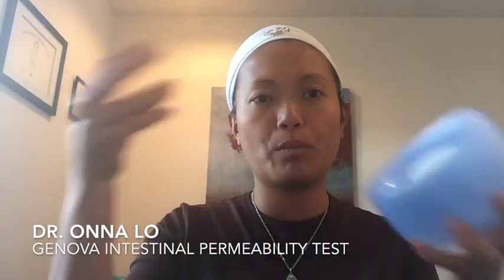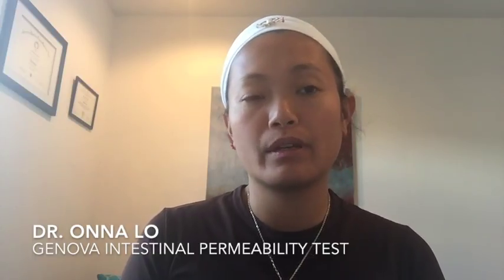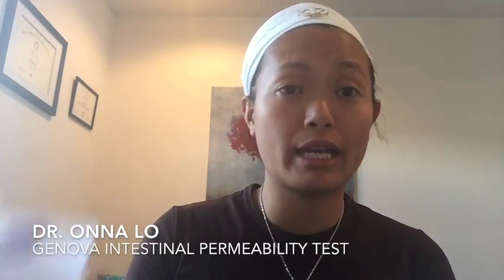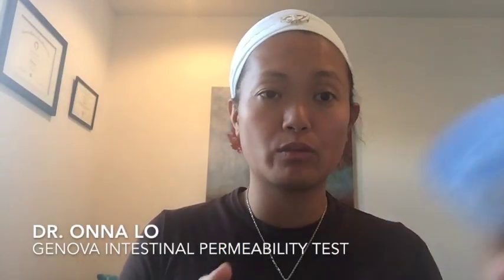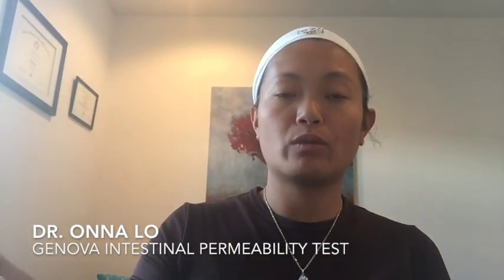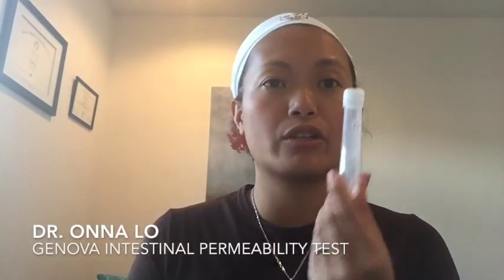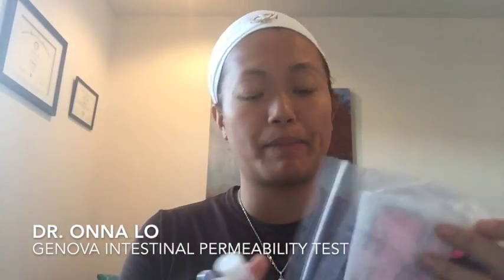The first urine you take, you want to pee into this container. If somehow the night before you had woken up in the middle of the night to pee, I would suggest saving that also and mixing it together. Refrigerate it, then the next morning mix it with your first urine, shake it, and pipette it into this tube, then put it inside this bag.